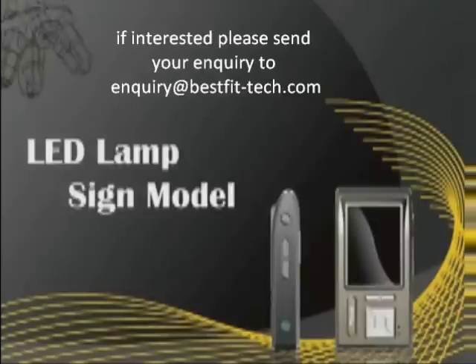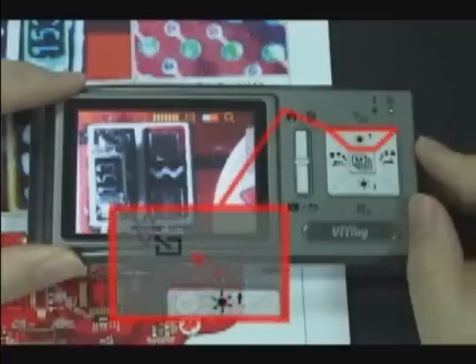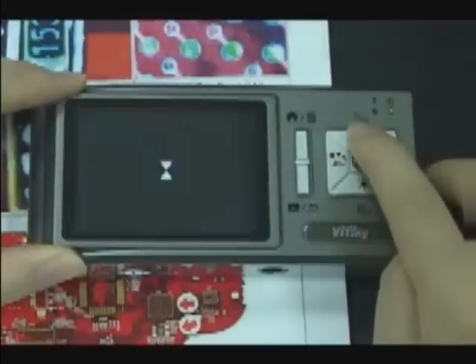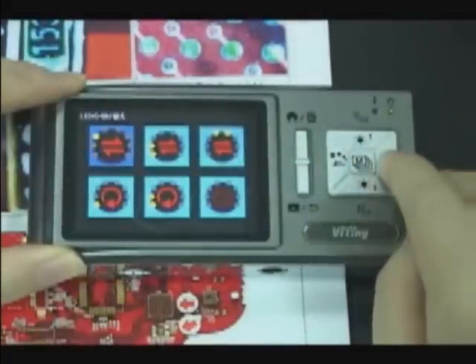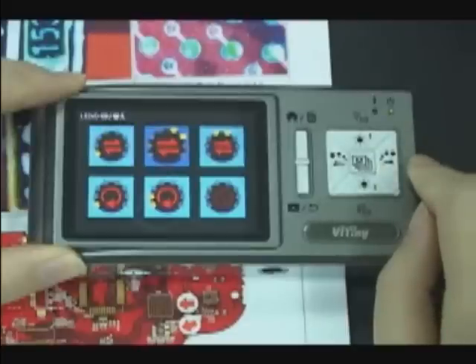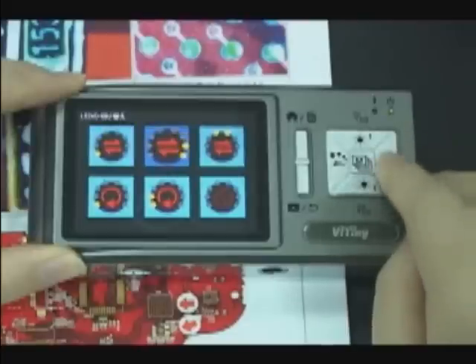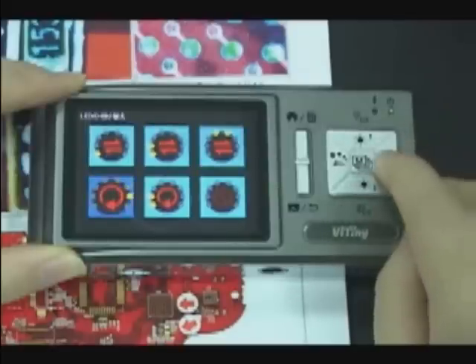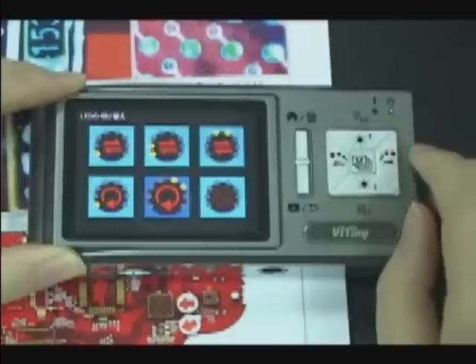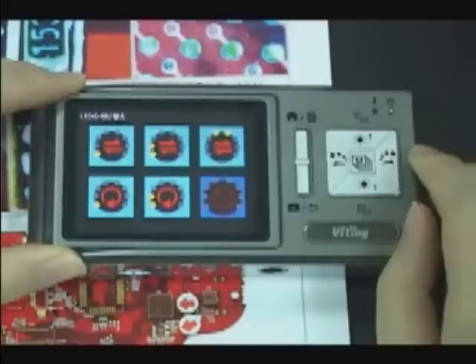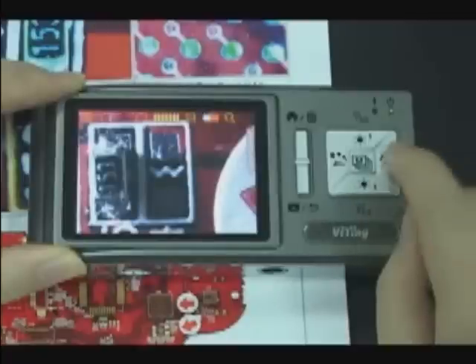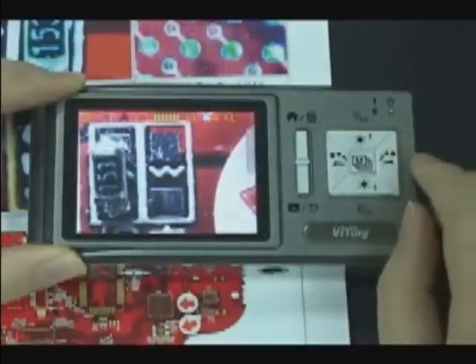LED lamp sign mode. Press the up button for a long time to switch lamp sign mode. It has six modes: manually switching mode to light one lamp, manually switching mode to light two lamps, manually switching mode to light lamps progressively. Select one mode and press the middle button. If you use the manually switching mode, press the left or right button to switch the lamp signs.